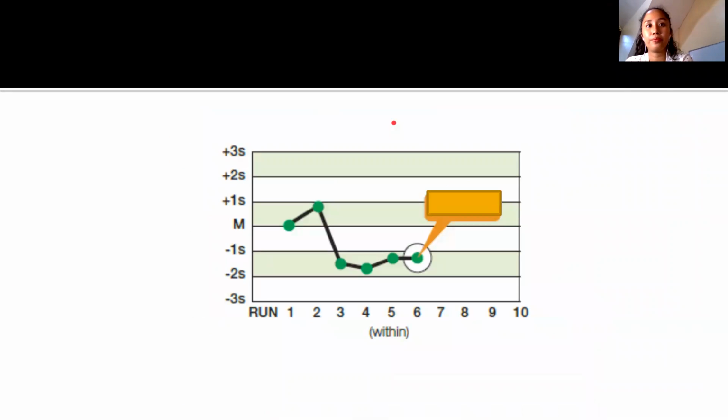Yan, here. So, papansin natin, it's beyond 1S. Yung katabi niya, nasa 1S rin. Itong nasa day 4, nasa 1S rin. Ito nasa day 3, nasa 1S lang rin. So, this is for 1S rule. So, ano to? Random error, systematic error.